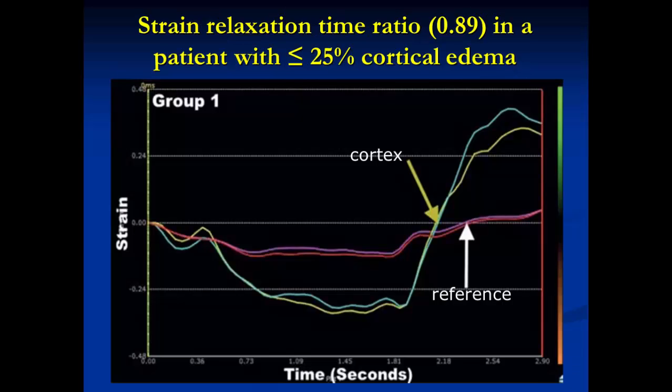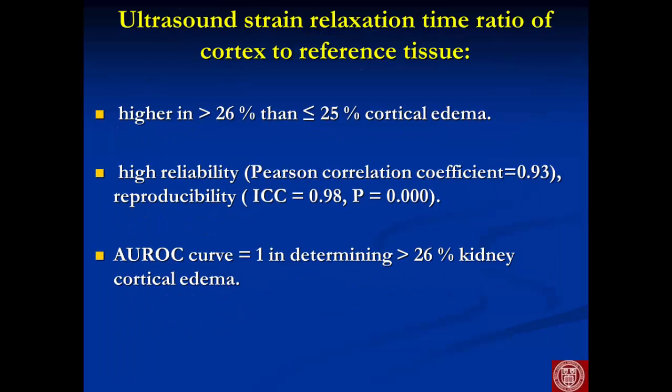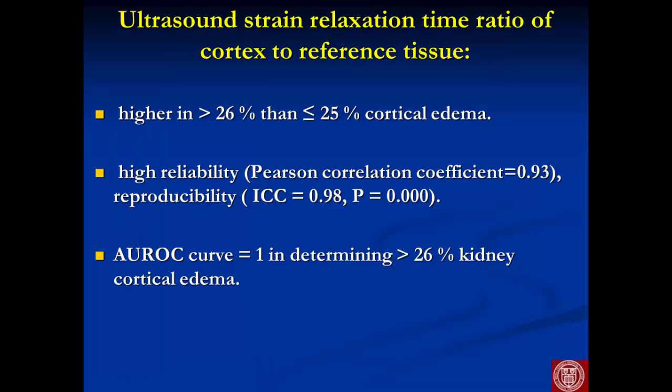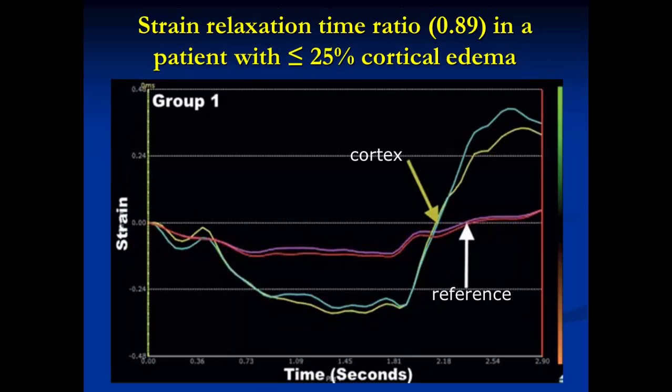Here's a case. This strain graph is from a patient with less than 25% cortical edema. This is the reference strain.